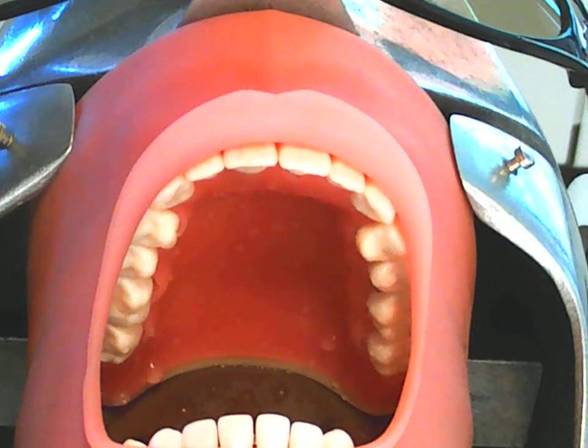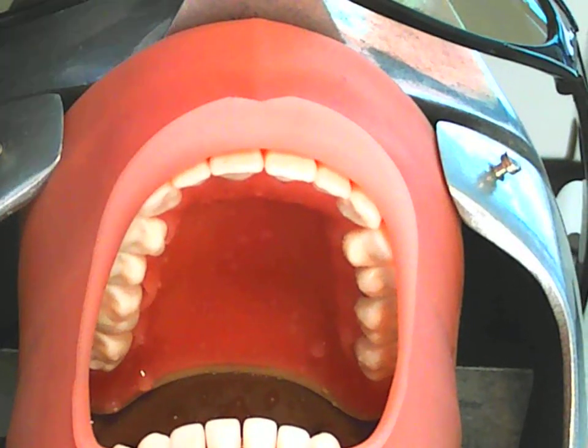When you're punching this dental dam for a single tooth, okay, you would just simply do that. Use the tooth hole size for this type of clamp. The clamp that we're going to be using looks a little bit different than what you've been used to. It's the 212 clamp, okay, and there are others out there on the market, but it's twisting on me a little bit. Okay, so it looks something like that.